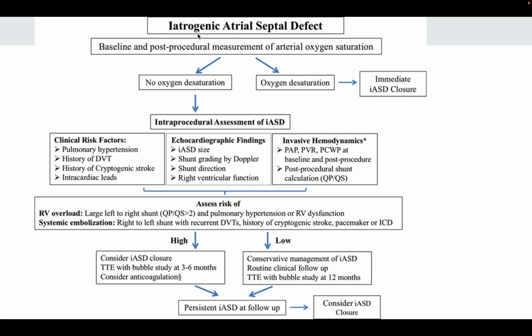This is a proposed algorithm that was documented in Circulation, which is one of the interventional cardiology algorithms for iatrogenic ASD.